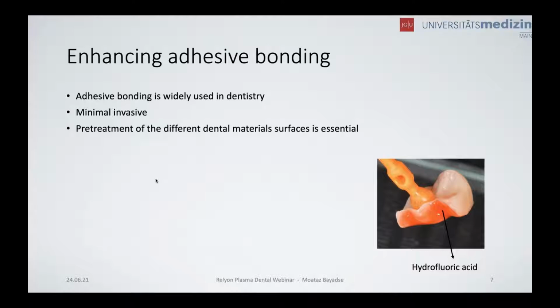But in order to get a long-term stable attachment, the surfaces must be pre-treated, and how to pre-treat them depends on the composition and the properties of the materials.